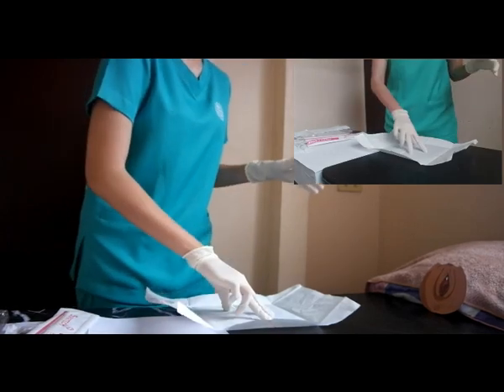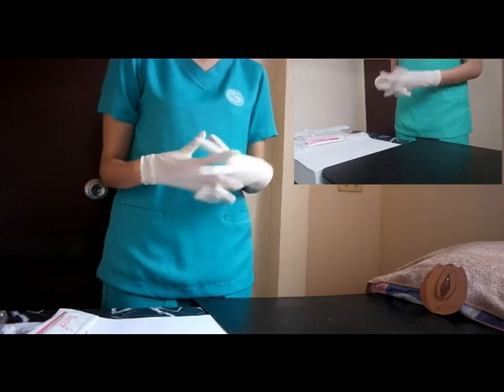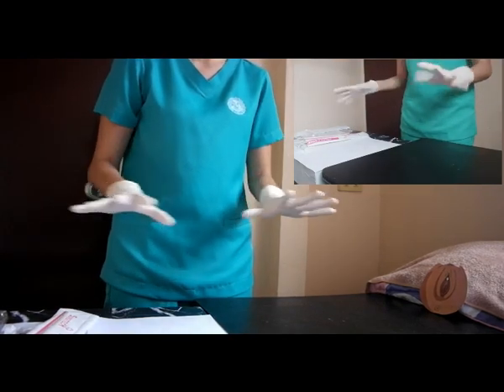So after you have worn your gloves, you're already sterile, so make sure that you're not touching anything.